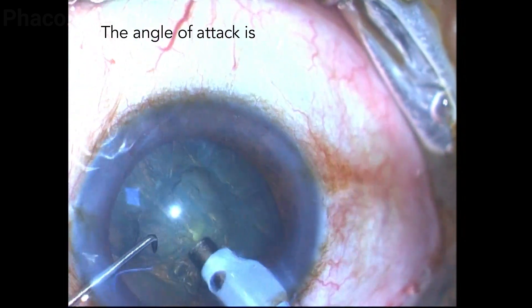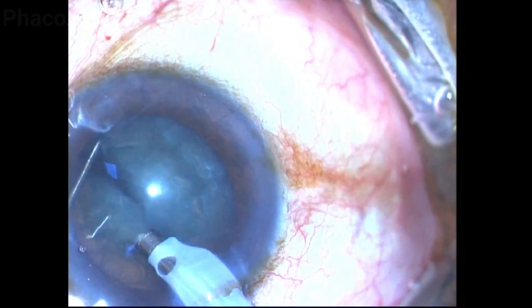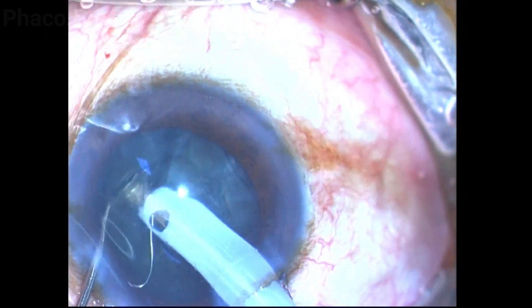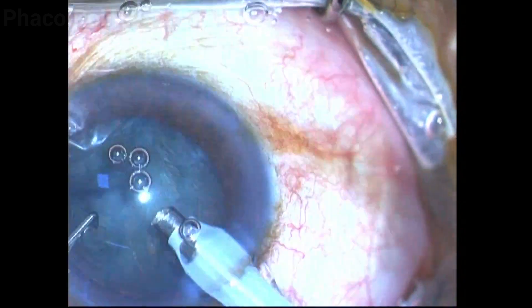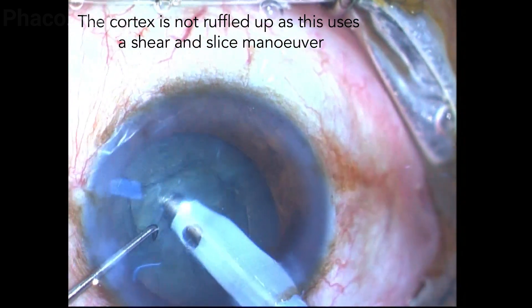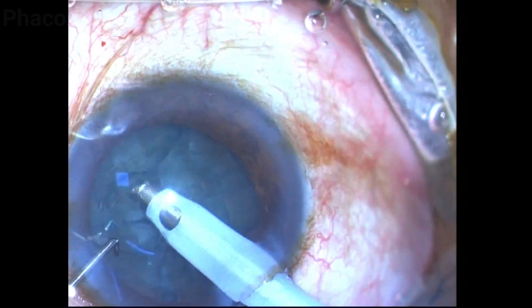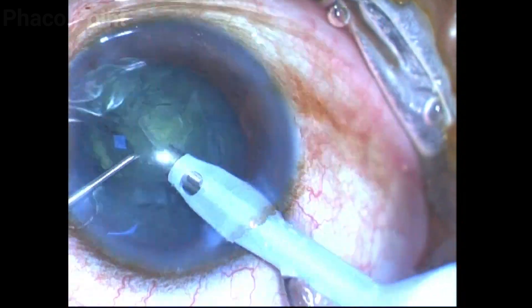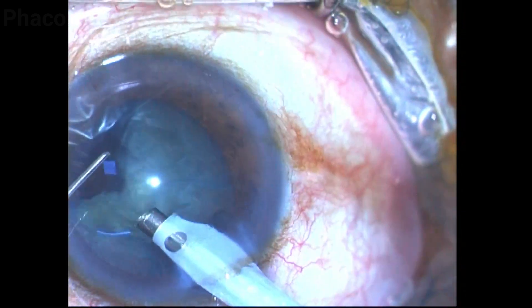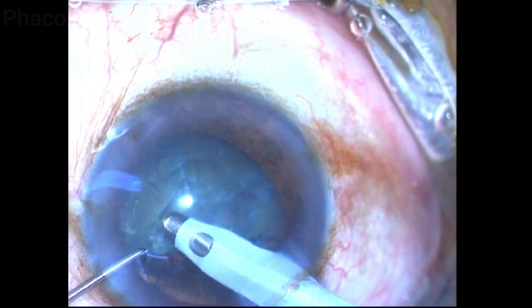The power setting is just 20 percent here and the vacuum is about 300 millimeters of mercury. The hold is very shallow — I bury the phaco tip in a very shallow hold and carry it longitudinally a short distance; a very short burst of phaco power is given and the nucleus is predominantly held with vacuum. Once you hold it by vacuum, all you have to do is take the sharp tip chopper and cut the soft lens like a cake. The trick is to maneuver this around until you are able to get one free fragment, and once this free fragment is mobilized out of the capsular bag into the central safe zone and emulsified, the game is pretty much under control.